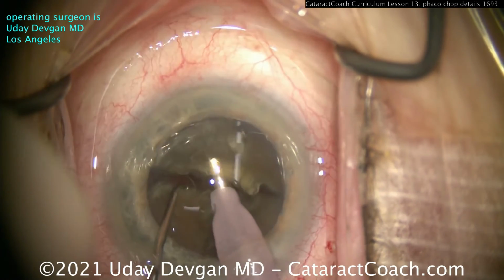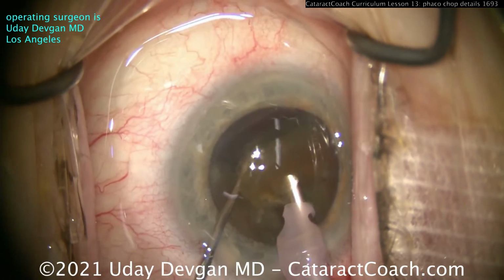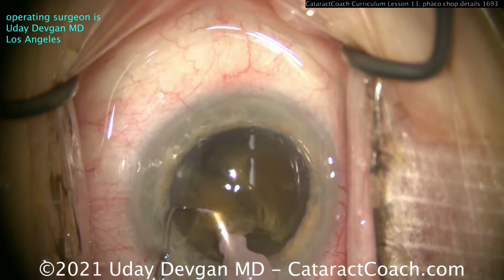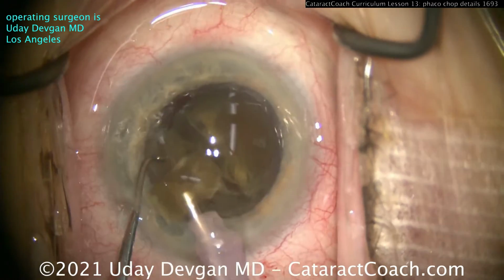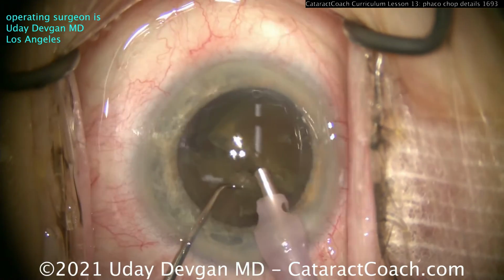And you can see there's some density in this thing. So make sure I separate it out, bring the first half up. And now I won't just wolf it down, I'll chop off a small piece. Let's take that piece down. Beautiful, nice and easy. And now we'll buzz into that same quadrant, or heminucleus actually.